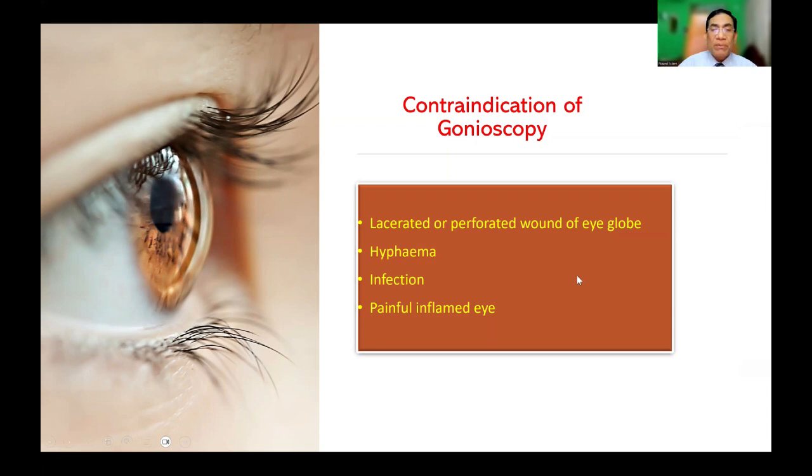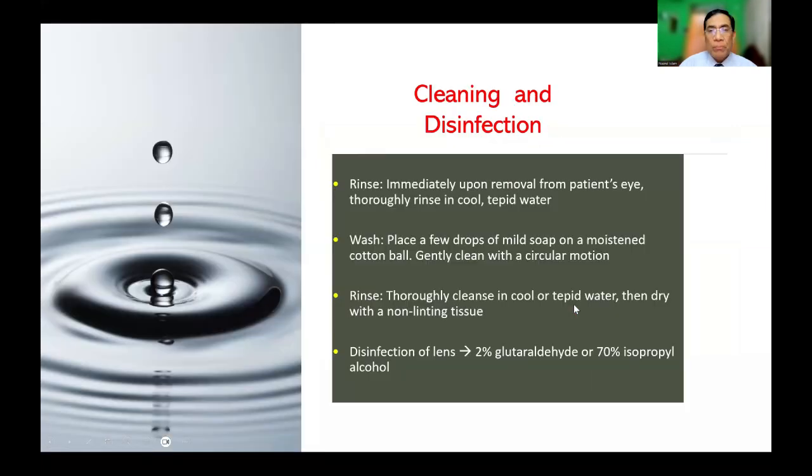After this, I think there are some conditions in which we should not do this. What are the contraindications? Definitely when there is a lacerated or perforated wound of the eye globe, hyphema, infection, or a painful inflamed eye, we should not do gonioscopy.